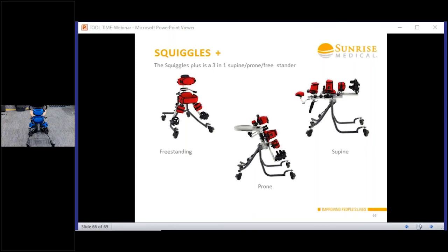So if you're using this stander, if you're setting different angles for therapy versus, I guess, functional tasks and social engagements, you can pick that angle, and carers and mum and dad can change that really easily. This stander is currently set as a prone stander, and we can make it a supine stander as well. It comes all the way back into a horizontal position to make transfers really easy.